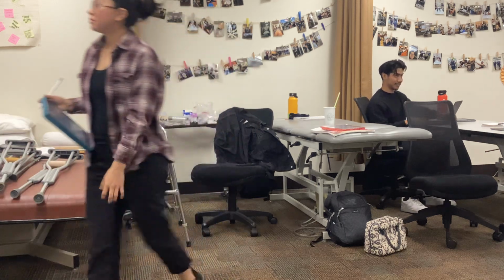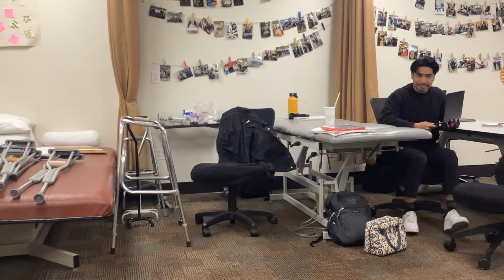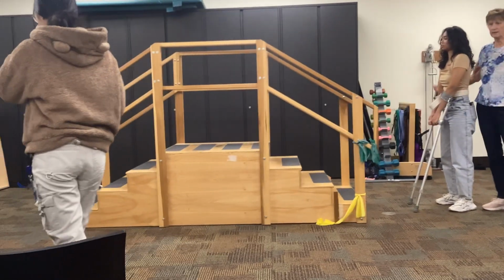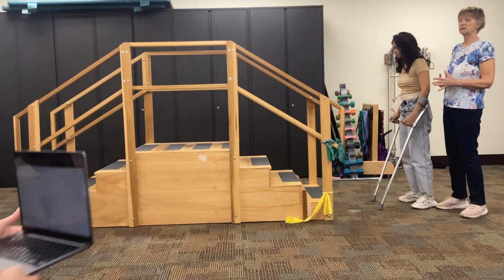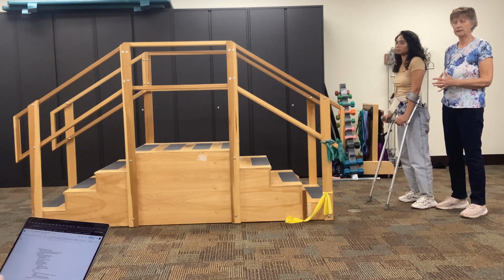Alright, so this particular gait is hard for me to pretend, for you guys to pretend. So what I want you to do is to give it a try, so you can feel a little bit of what it would feel like for that patient.